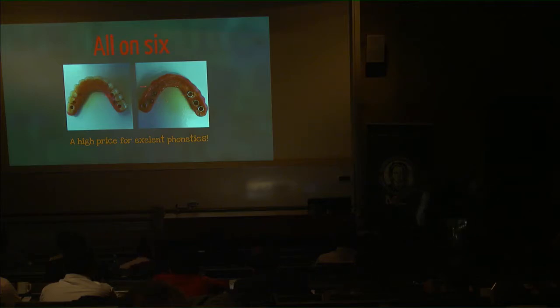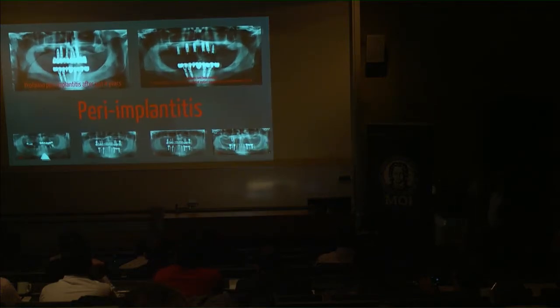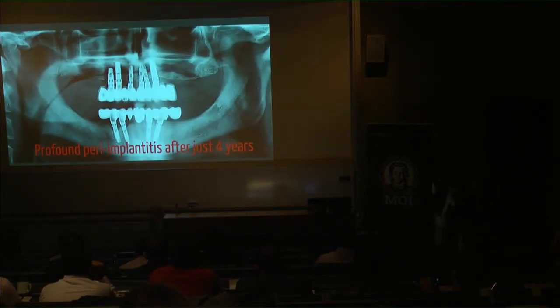And now they even developed it, so they put extra acrylic on the buckle for better phonetics, which is great. But how can this be a surprise? It's impossible to clean. You'll 100% sure get peri-implantitis. Another case. Is this too depressing?